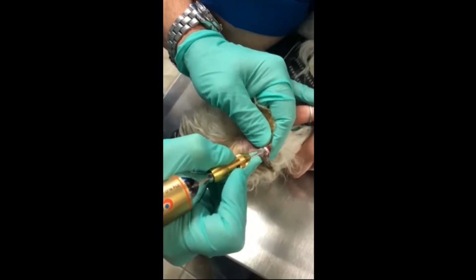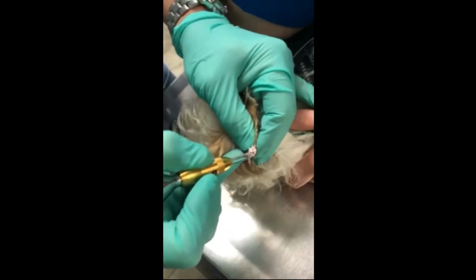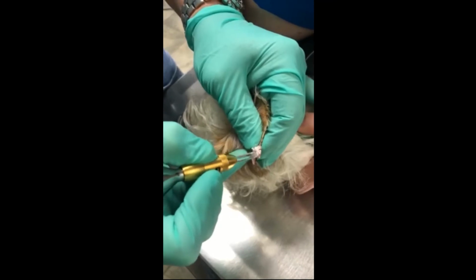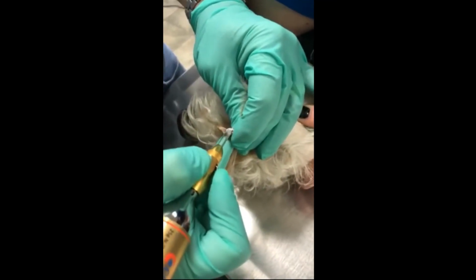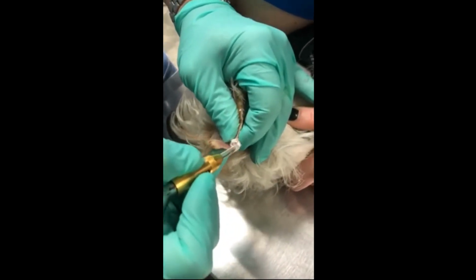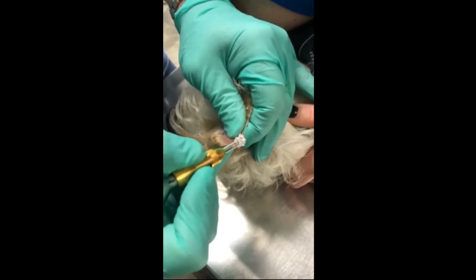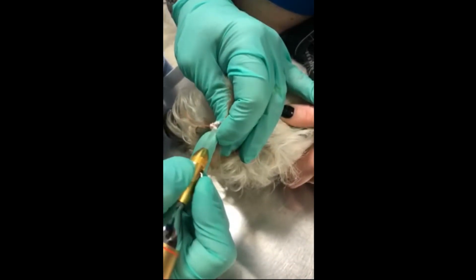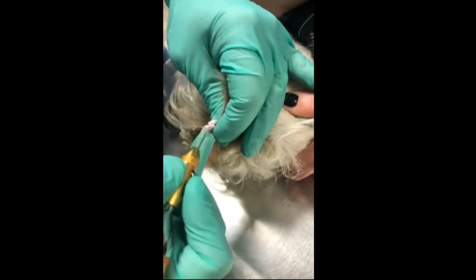By the way, we're trying to make sure that we get contact with the mass, and so we are literally scraping or brushing off the frost as it occurs. The reason for the masks is because of COVID. It has nothing to do with the freeze procedure. And as far as gloves are concerned, I wear gloves because I would prefer not getting the frost on my fingers, but it is not necessary.